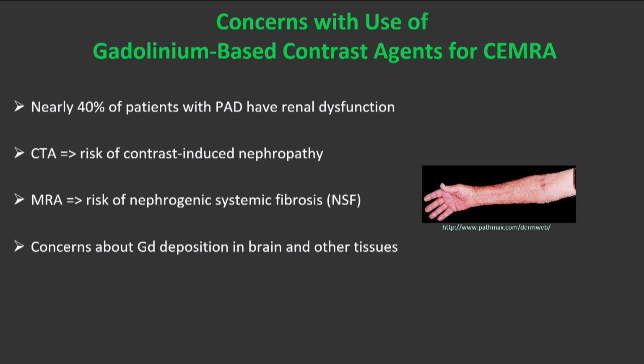However, of course, there was a rather big shock to the system when people discovered that giving massive doses of gadolinium wasn't really healthy. We should have suspected that just from the fact that gadolinium is a calcium antagonist and has some sort of nasty physiological effects, but this is kind of something different. And so when NSF was discovered, we had to sort of step back and say, well, maybe we shouldn't triple or quadruple dose people with gadolinium, which actually was pretty standard at the time.